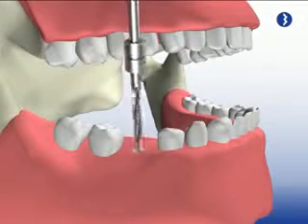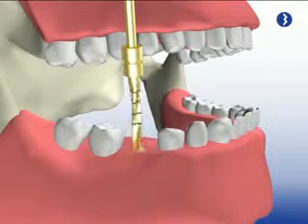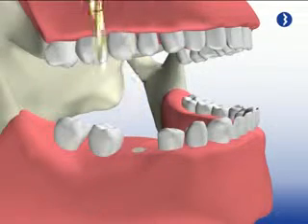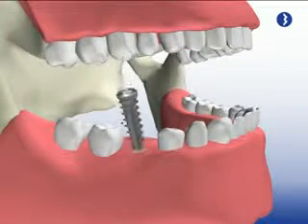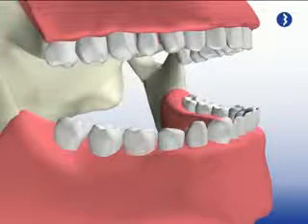Inadequate temperature control during drilling or excessive pressure could cause an osseous fracture and undesirable osseous reabsorption. The Treenon system should be followed by its design, with a simple drilling sequence for implants, according to the type of bone involved.